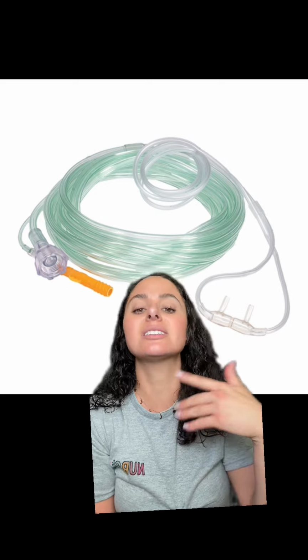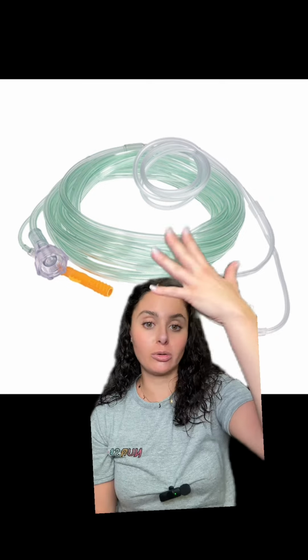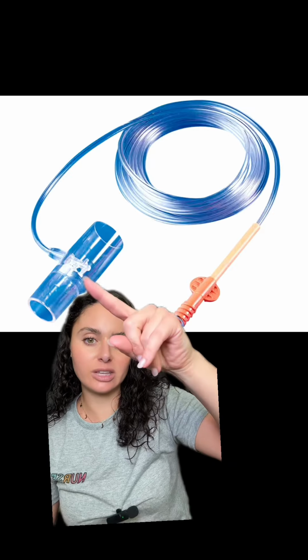This is one device we use to measure End-Tidal CO2. This is just a nasal cannula. It can also be hooked up to oxygen, but it doesn't have to be hooked up to oxygen in order to measure End-Tidal CO2. And then this little orange device can hook to a little pump or your bedside monitor to show your waveform. Different device, same concept. This one usually hooks up to a ventilator. So you have an in-circuit End-Tidal CO2 that is directly connected to the patient's ventilator.